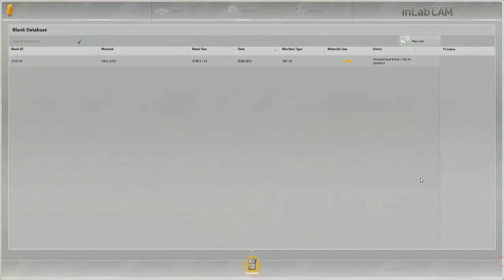Welcome to this tutorial on InLab CAM software 15. This video demonstrates the collection of several jobs to the multi-block holder.